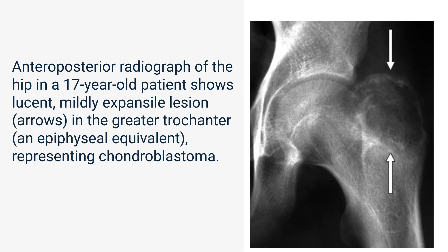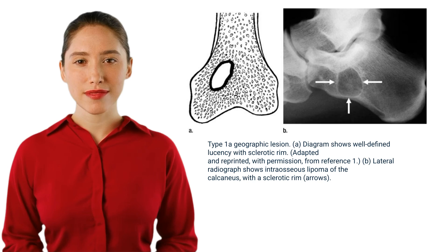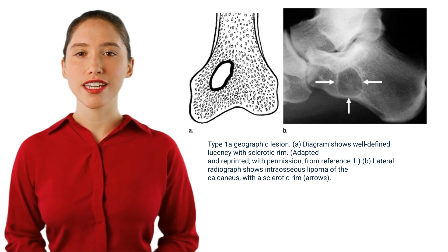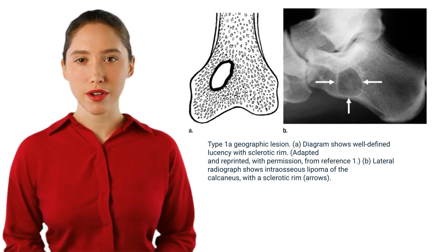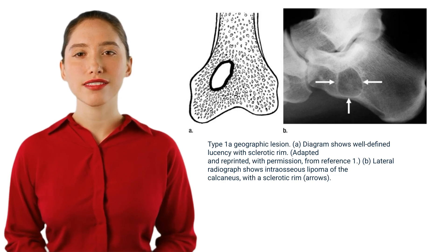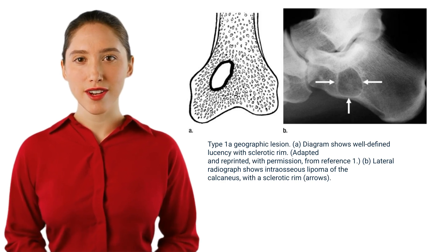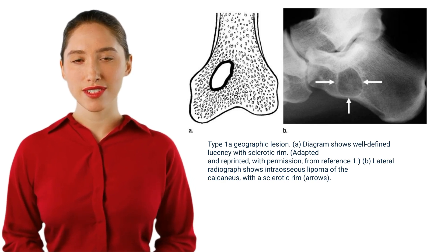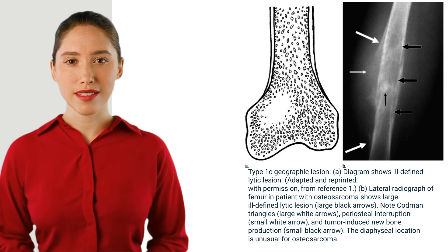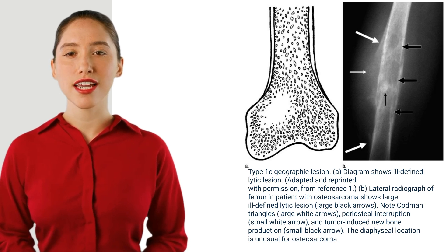Anteroposterior radiograph of the hip in a 17-year-old patient shows a lucent, mildly expansile lesion (arrows) in the greater trochanter — an epiphyseal equivalent representing chondroblastoma. Type 1a geographic lesion: diagram shows well-defined lucency with sclerotic rim. Type 1b: lateral radiograph shows intraosseous lipoma of the calcaneus with a sclerotic rim.